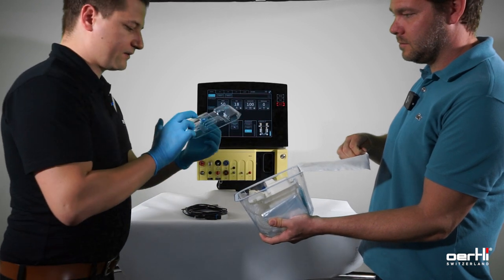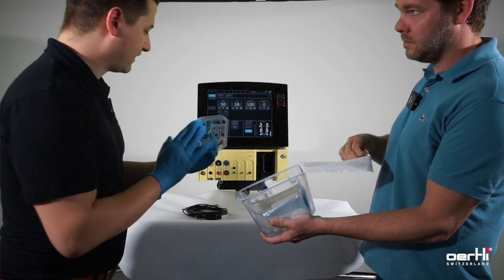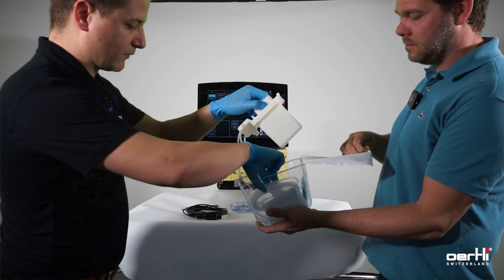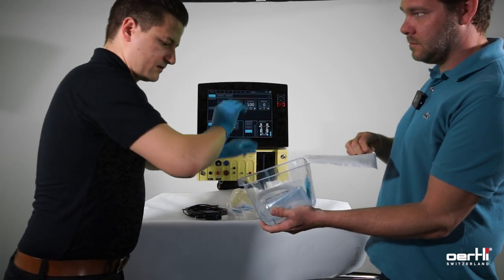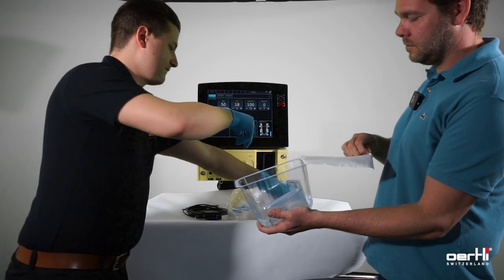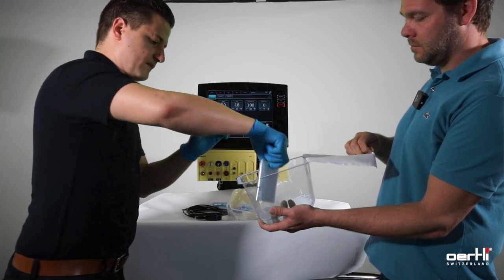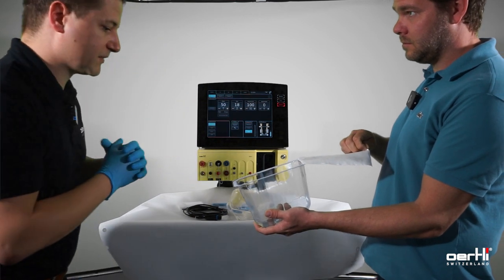Either we can discard the plastic one immediately, or we just place it on the table. Be careful when removing the contents. There we go — the box can now be discarded.